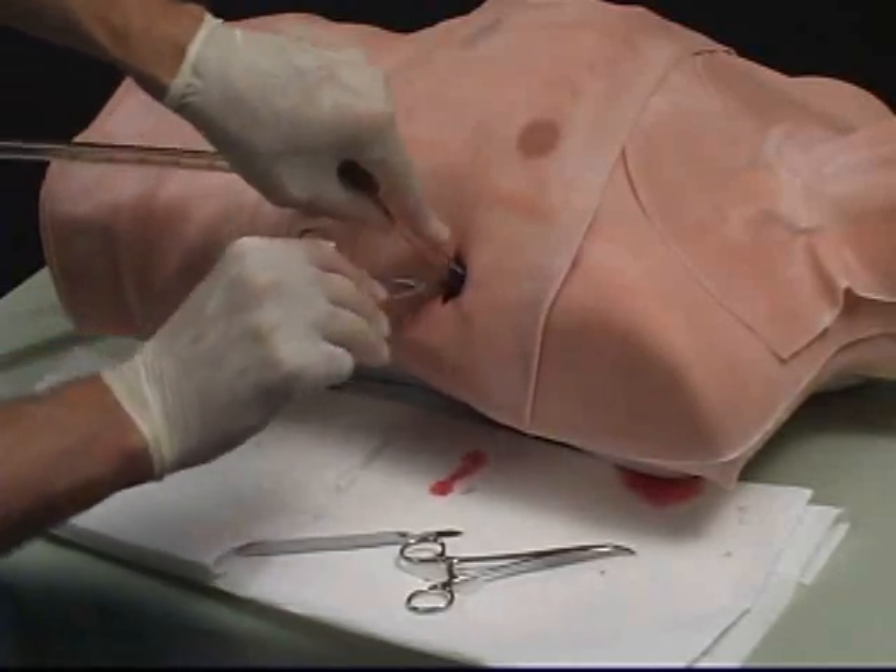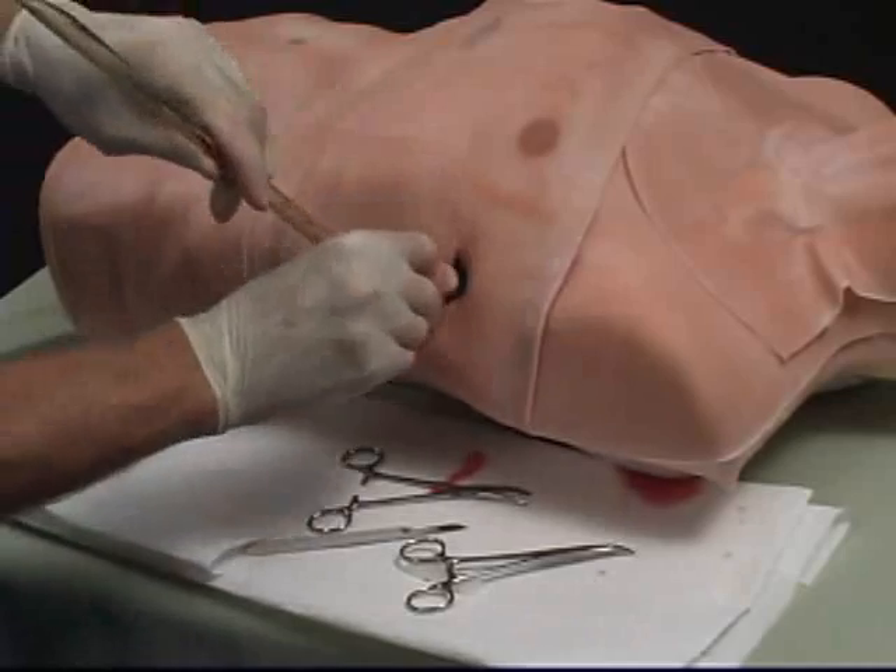Once the tube is inserted into the correct position, there will be airflow at the distal end of the tube.